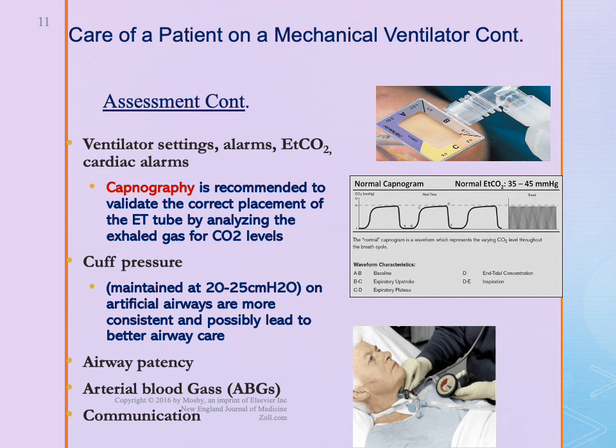Another thing that we would need to assess would be cuff pressures. Actually, with that cuff pressure, let's use the parameter that is in the ventilator-associated pneumonia bundle.